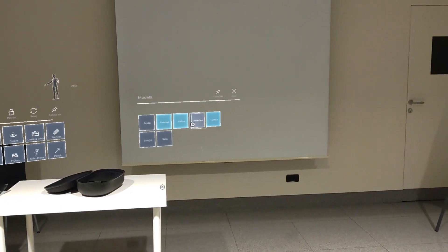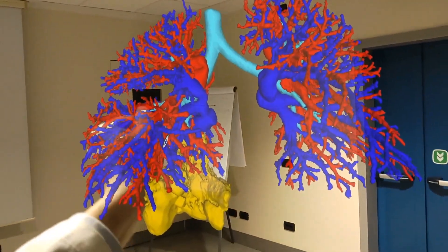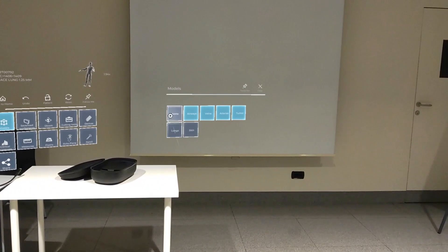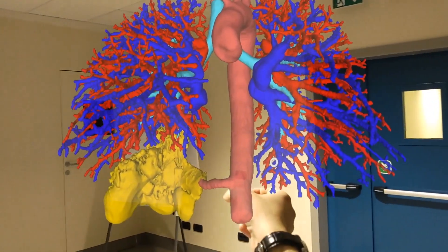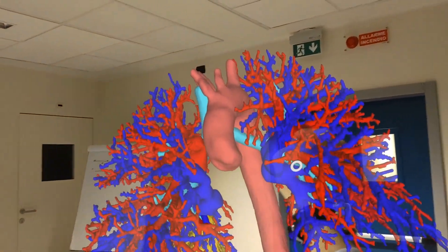We then visualize the venous system, disclosing the standard anatomy of the right lower pulmonary vein, and subsequently we reintroduce the pulmonary artery system and then the aortic feeding artery and the whole aorta to have a global view of the surgical field.